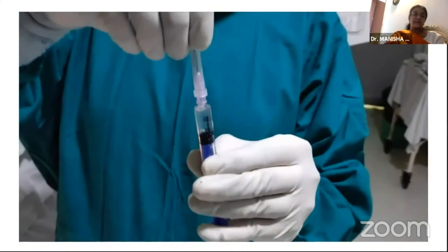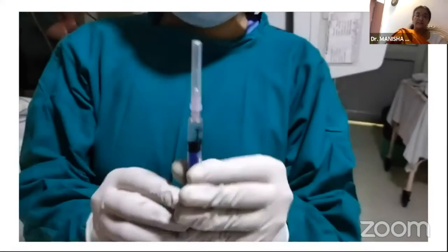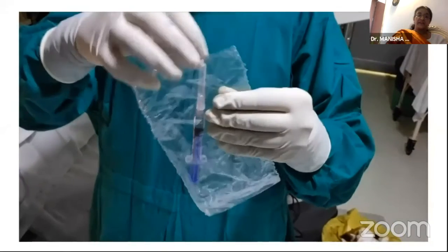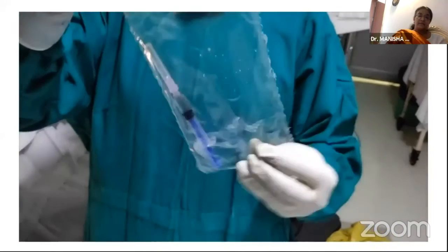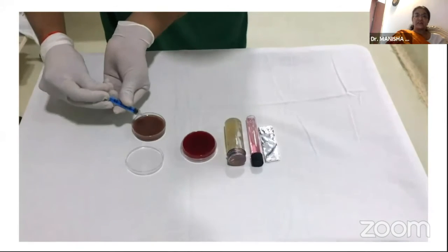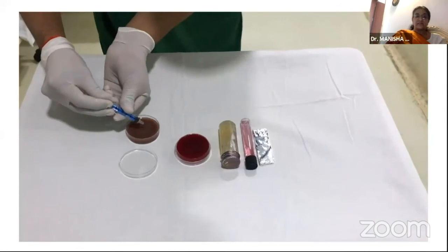You finally cover up the syringe and the needle, and put it in a sterile pack, which is sealed with proper labeling with the name of the patient and the diagnosis.